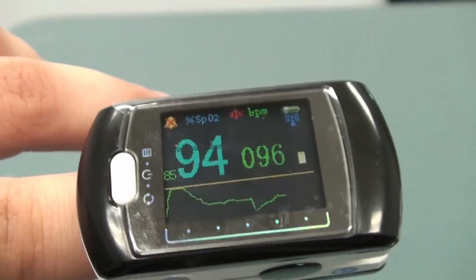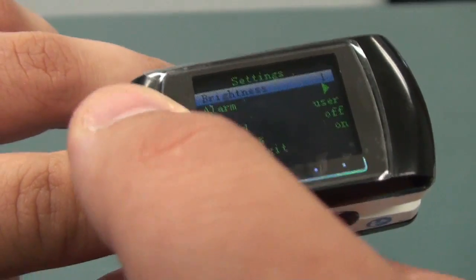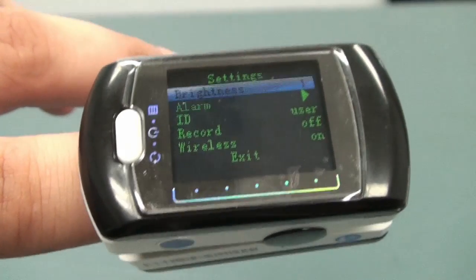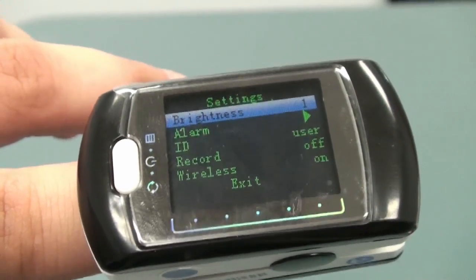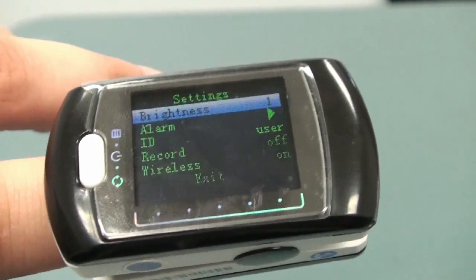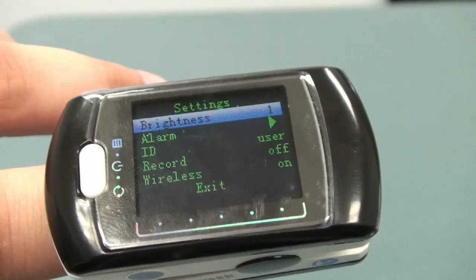When the device is showing horizontal, you'll be able to access the menu. Press and hold the power button and the menu will appear. You can adjust the brightness of the device, change the different alarm settings, have an ID, and if this device is a Bluetooth option, you're able to turn on and off the wireless.